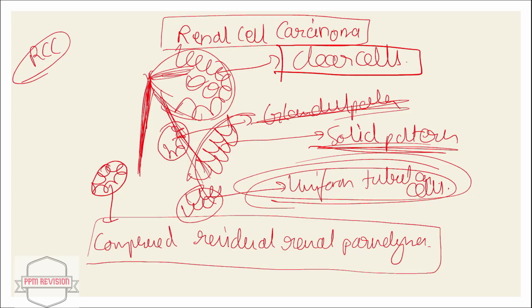Next, the tumor cells are arranged in alveolar structure in some parts, as papillary processes projecting into cyst-like spaces at the other parts. And the cells are large, polyhedral or cuboidal or columnar, and the nuclei are small and deeply stained, cytoplasm clear and vacuolated due to lipid, glycogen and hydropic degeneration.